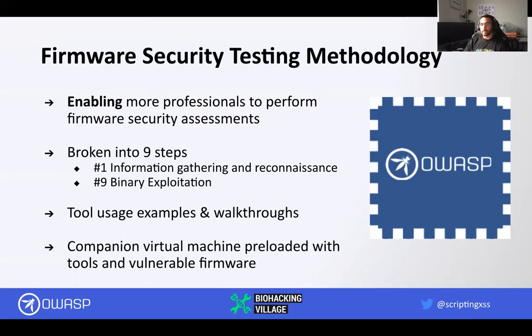We've gone ahead and provided tool usage examples and walkthroughs, again, to help show and teach the common techniques and the common tools. What we've done is create a companion virtual machine with preloaded tools and vulnerable firmware, such as IoTGoat, but also a few others that the industry has provided, and even some with known vulnerabilities for products and manufacturers out there, zipped up, trying to keep the space minimal.